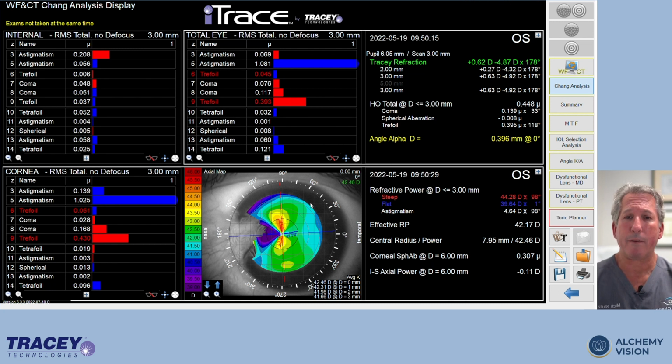So the patient came in for cataract surgery, and what was very clear on the exam, as you can see here, is the patient has a significant pterygium that's causing astigmatism. It's causing flattening here and steepening here, and that is something that we absolutely want to take care of before we actually do cataract surgery for a patient like this. If we are to operate on a patient like this with the pterygium, that will make our results unpredictable.